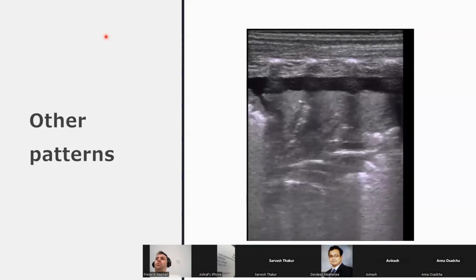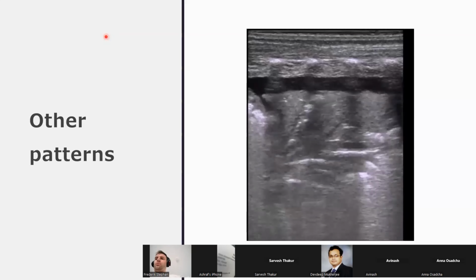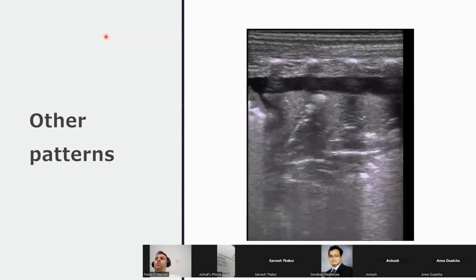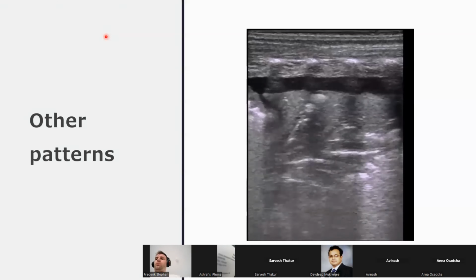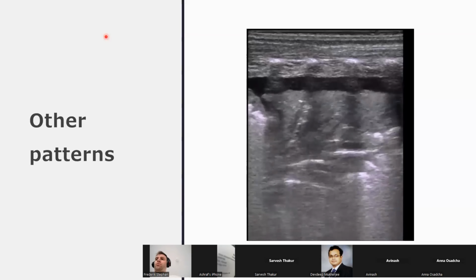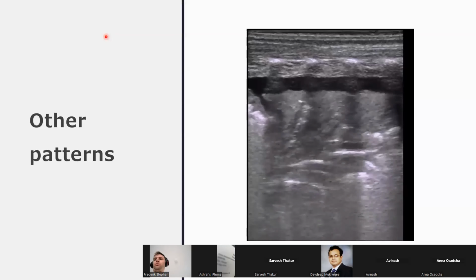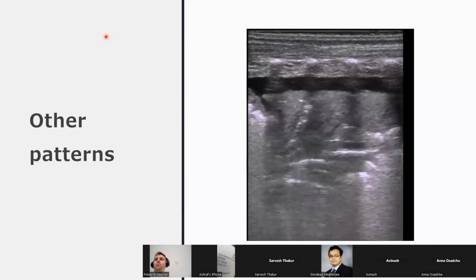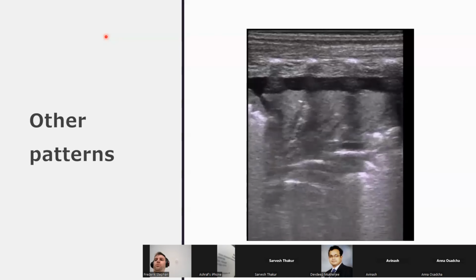If I give you background and say that this is basically a preterm baby who is deteriorating with rising FiO2, rising CO2. This is the left lung. The rest of the lung is very homogeneous RDS-like, but on the left lung, we have this appearance. Yeah. So, I believe this baby is vented, of course, right? Yeah. So, first of all, we need to make sure that DOPE protocol, we need to make sure the tube is in the right position. Yeah.